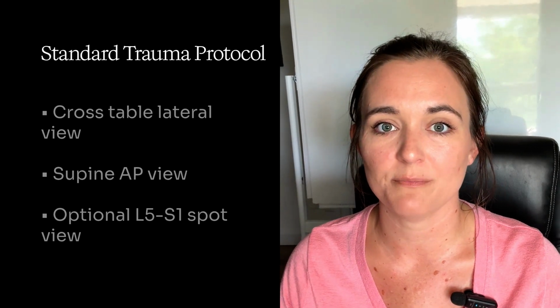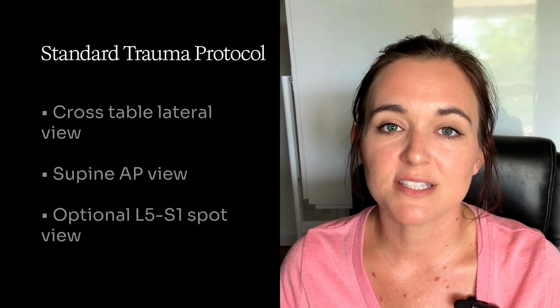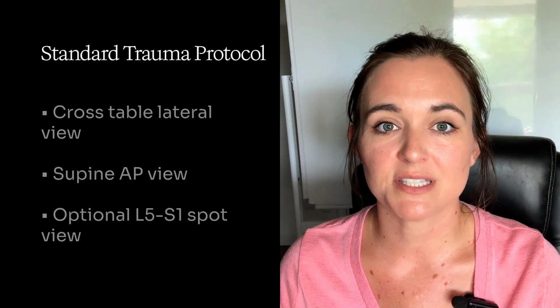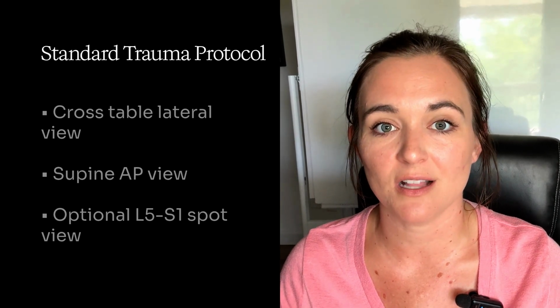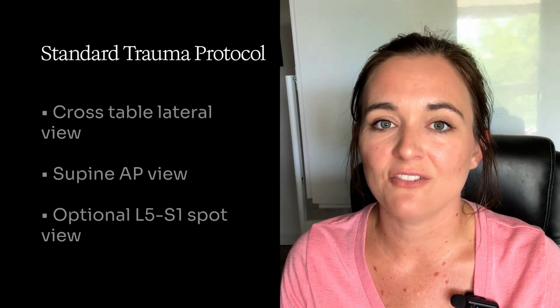Usually the L5-S1 spot view is optional, if you can safely get it, especially if the trauma is low or you suspect spondylolisthesis. You won't always get the spot view in trauma if the patient's in too much pain or can't tolerate any angling or extra views, but when you can, it adds a lot of value.